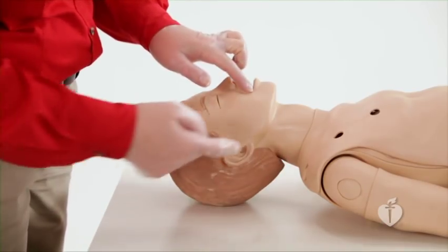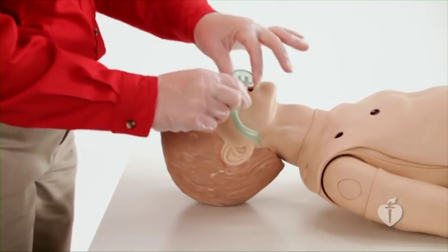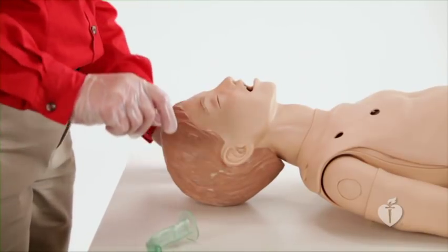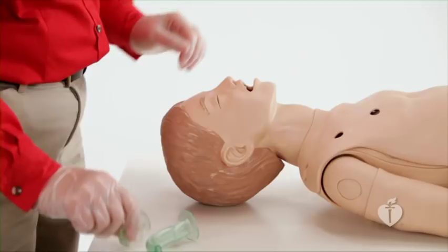If the infant or child is unconscious and has no gag reflex, an oropharyngeal airway may help maintain a patent airway. To select the correct airway size, place the airway next to the face. An appropriately sized oral airway should extend from the corner of the mouth to the angle of the child's jaw when the airway is positioned next to the face. If the device is too large, it may block the airway. If it is too small, it can cause the tongue to obstruct the airway.